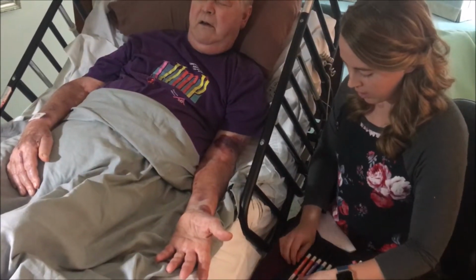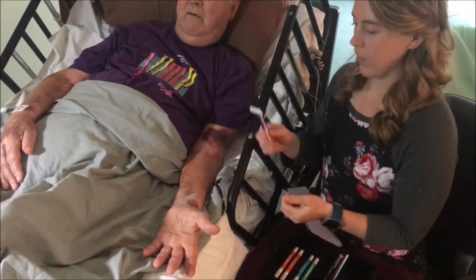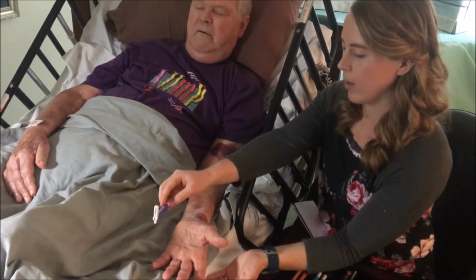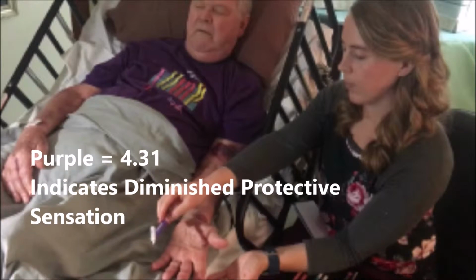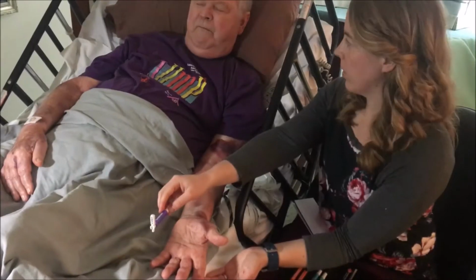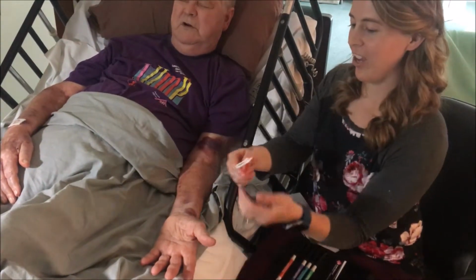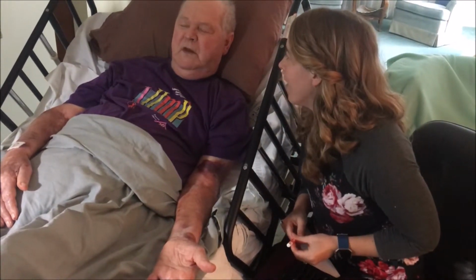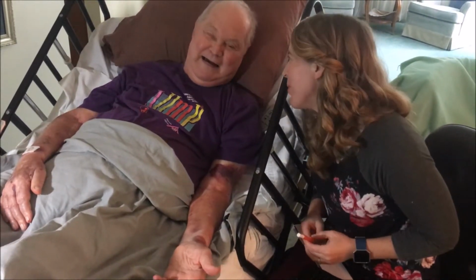Let's go up one more. All right. So eyes closed and say touch when you feel something. Good. You're a straight A student. We're done with the assessment. You can open up your eyes.